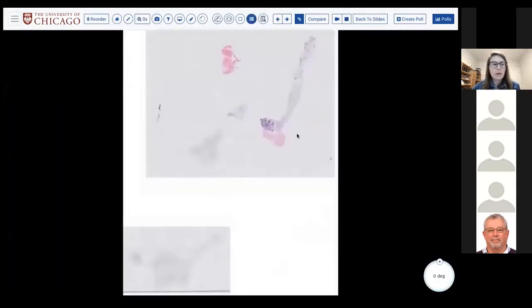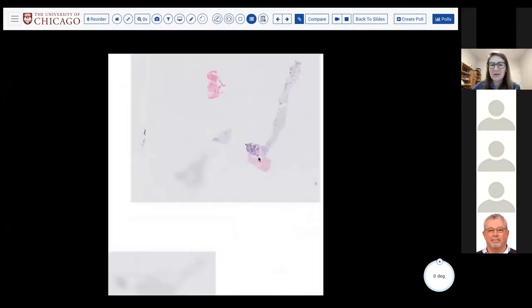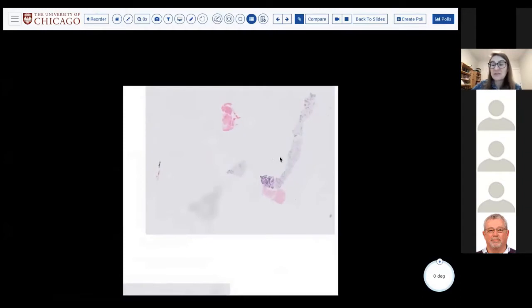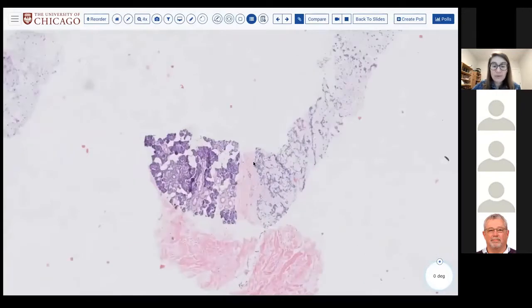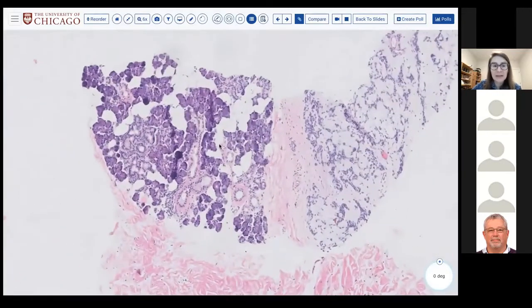All right, so virtual slide, awesome. So as I said, most of this lecture is going to be virtual slides, and here we begin. I would love this to be a little bit interactive, so if you guys want to pipe up with your comments, et cetera, in the chat, please do. So this is, as you can see, a core biopsy. I always like to look at the neighborhood, right? What's going on in the surroundings?